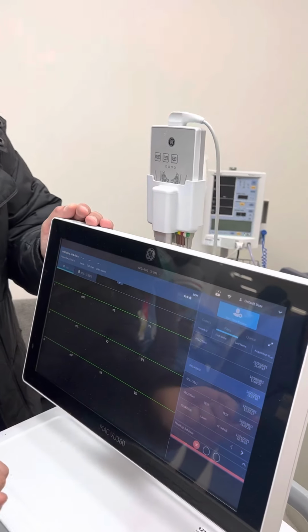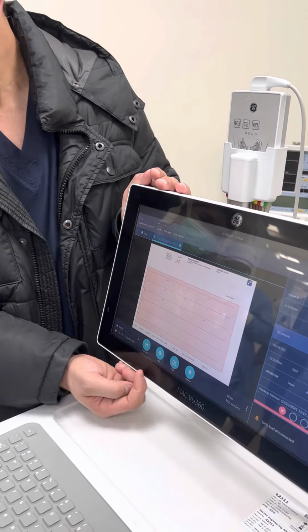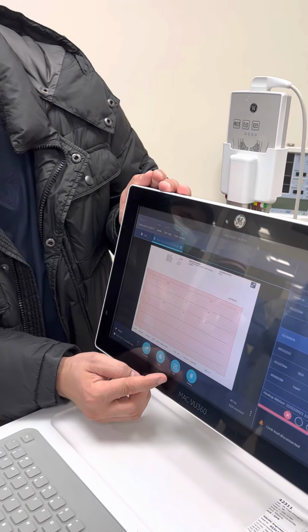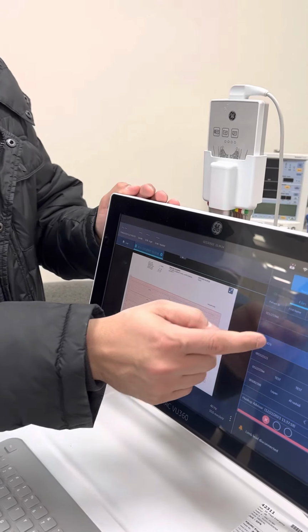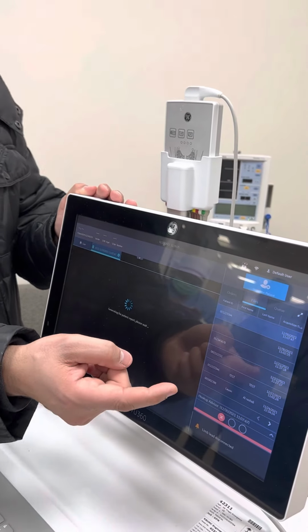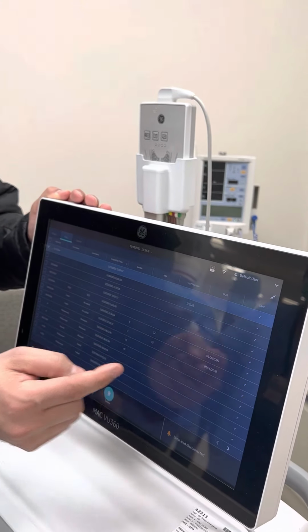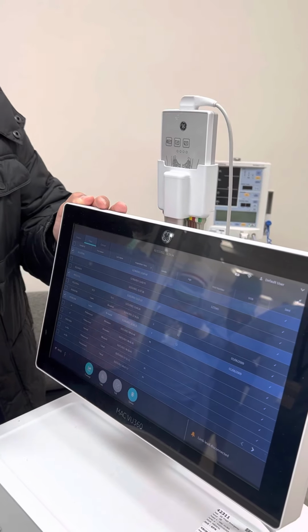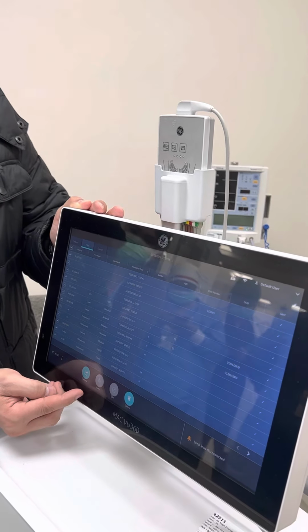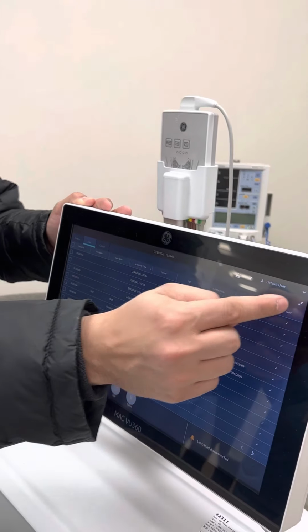So here, this is my patient. It will show you the options in here: transmit, get a copy, edit patient demographics, add, delete. Okay? So I can choose my report from here and do the transmit, or I can do the expand and choose these reports randomly, or I can select all and do transmit. Okay? So it's so easy, isn't it?